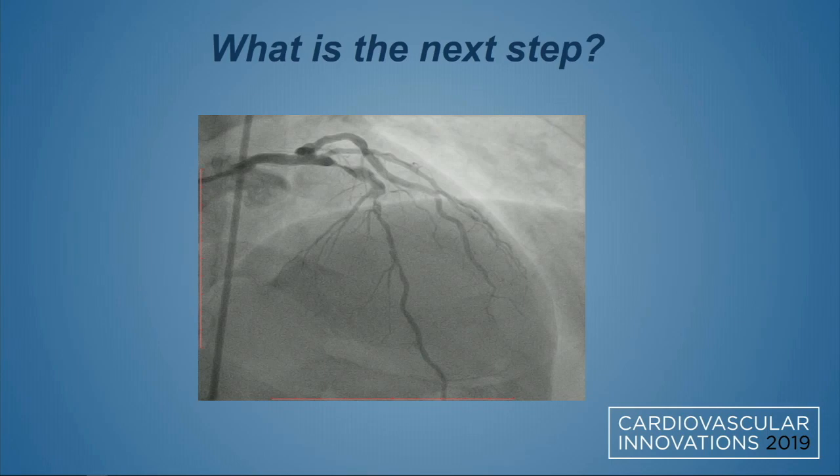In the sense of, if such a big aneurysm, you're just going to put a drug-eluting stent through it and that's going to seal it. I had a case like this before in acute STEMI, an inferior STEMI, and I put in a graft stent, and 1 month later there was stent thrombosis. So I have a bad history with graft stent, and I would be very hesitant, because he is a young patient. Covered stent, definitely. Yeah, that's why I would prefer that. That's a very good suggestion. And then you had time to decide and discuss with the heart team.